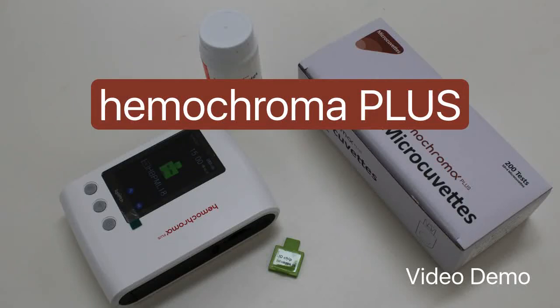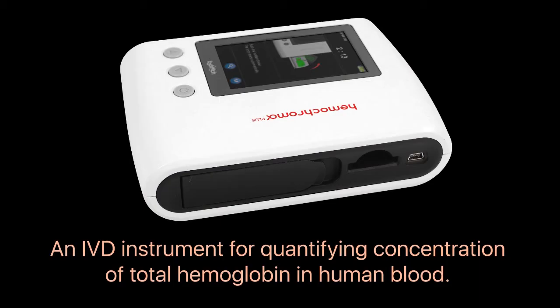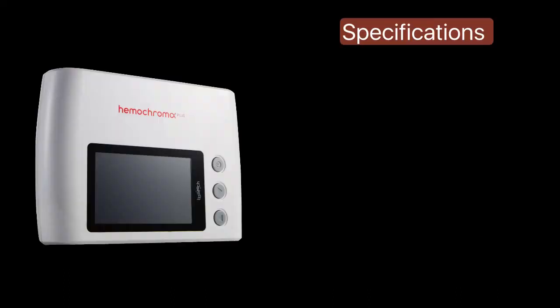Hemochroma Plus is a portable in vitro diagnostic instrument intended to quantify the concentration of total hemoglobin in human blood. The specifications of this battery powered handheld device are as follows.